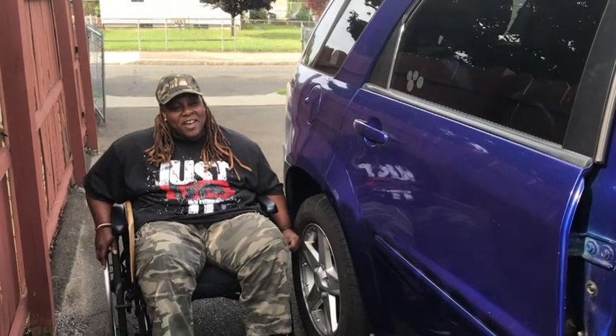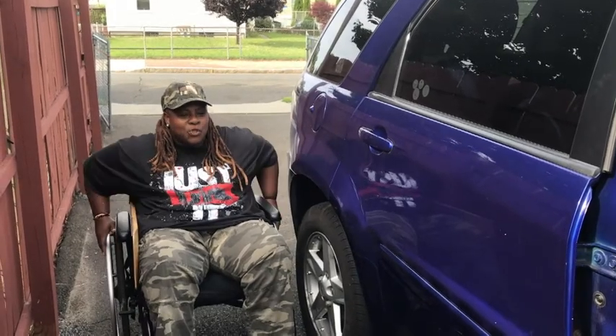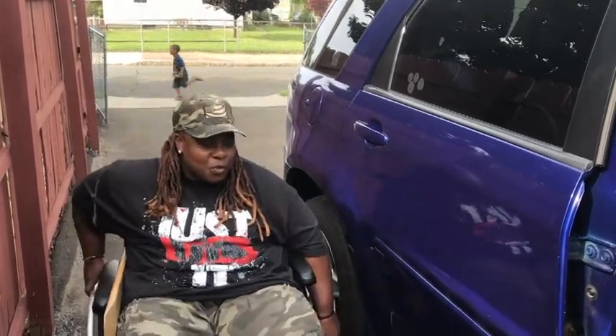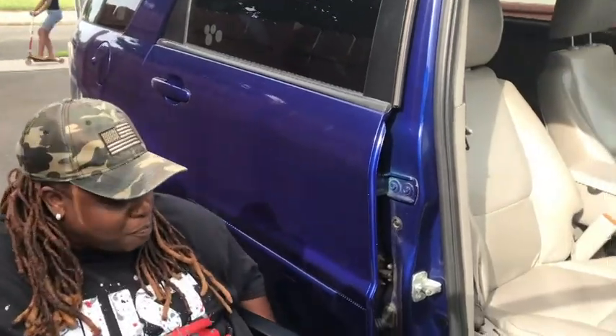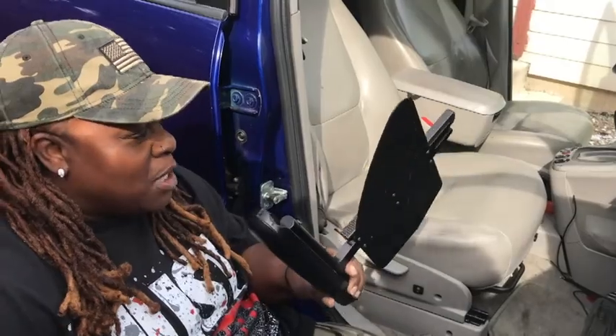My name is Nikita. Today I would like to demonstrate getting into this vehicle. It's a little higher than normal, that's why I chose this one.